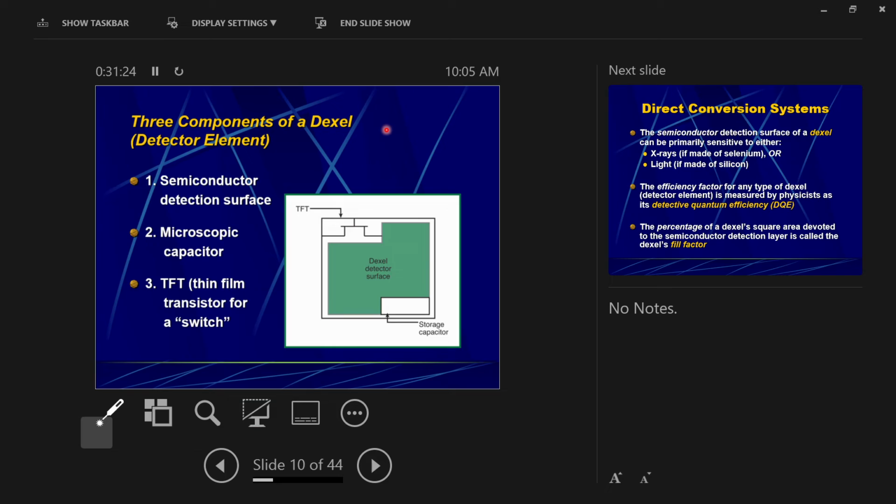And it knows which one it's reading at any one time, and it puts the exposure for that in a specific spot on the screen, and that specific spot is a pixel, and each pixel gets a value based on the amount of exposure given at each one of these detector elements. Does that make sense? Okay, I know we're dealing with a lot of really technical stuff today.